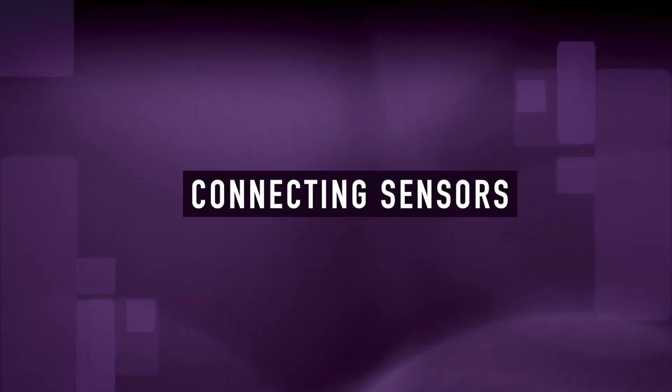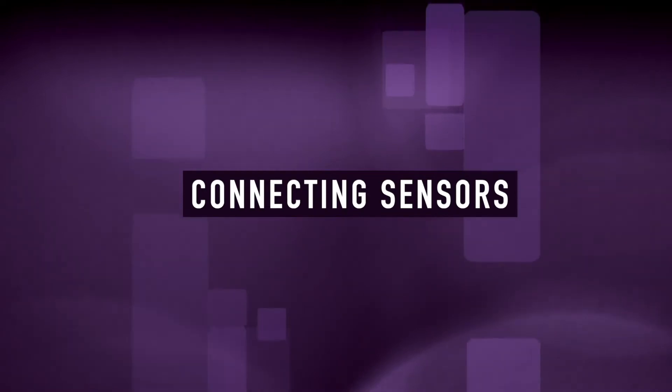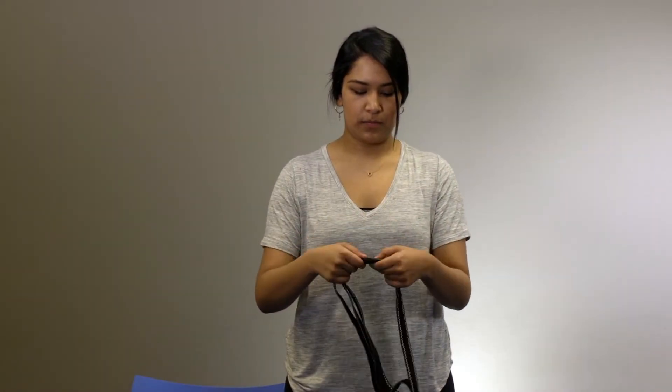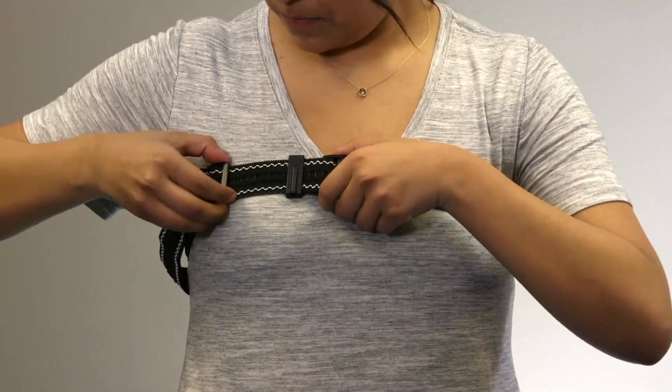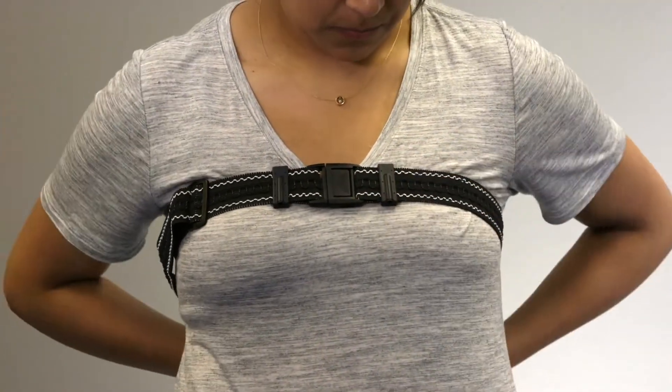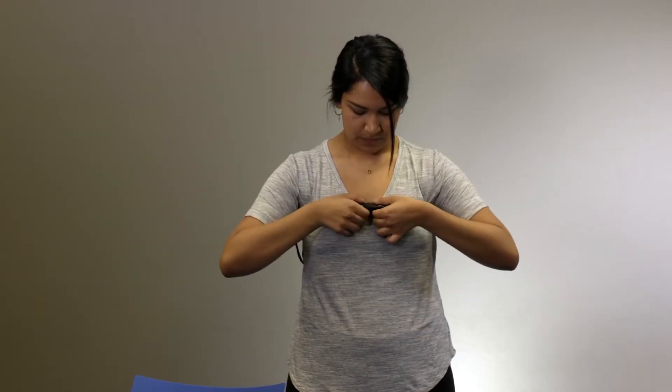If your provider has already sized the belts and connected them to the device, skip to the chapter 'Wearing Your Apnea Track.' Otherwise, adjust the chest belt to a tighter fit than you need using the plastic adjustment rings. Place the chest belt around your chest and fasten the buckle, then loosen it to a snug, comfortable fit. Remove the belt to finish the setup.